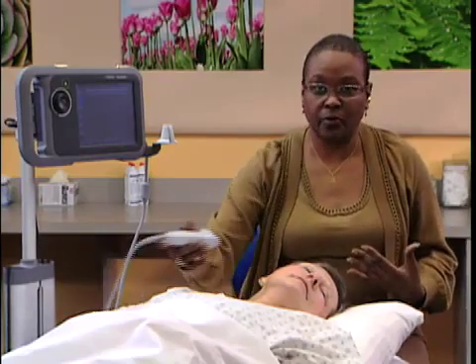I'd like to walk you through a demonstration of scanning the carotid artery for CIMT. One of the things that's really important is to position yourself as well as the patient comfortably. I like to scan from the patient's head, but many people like to scan coming from the foot.